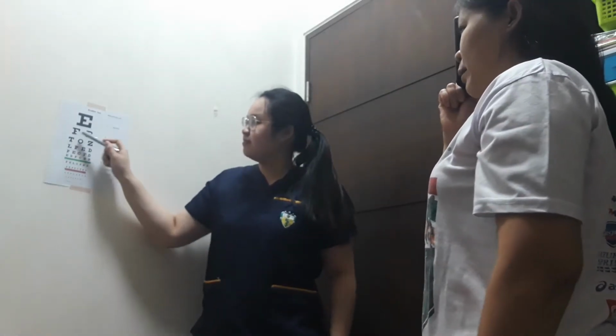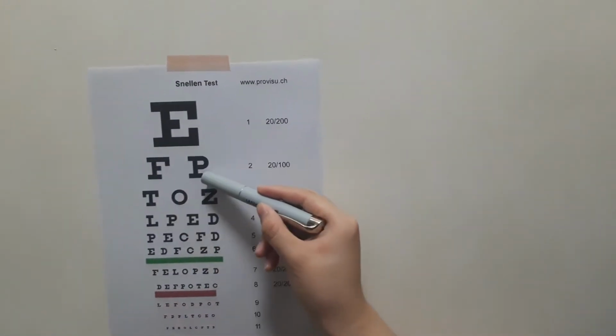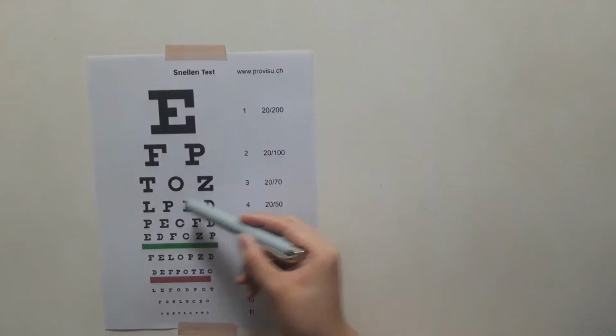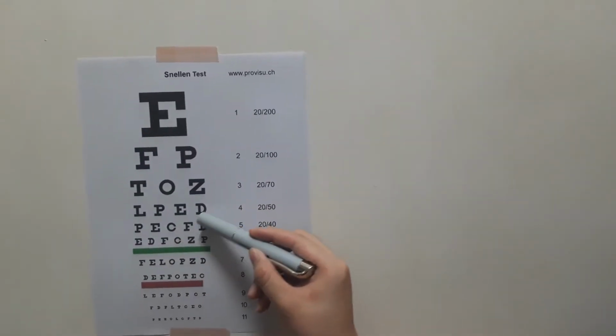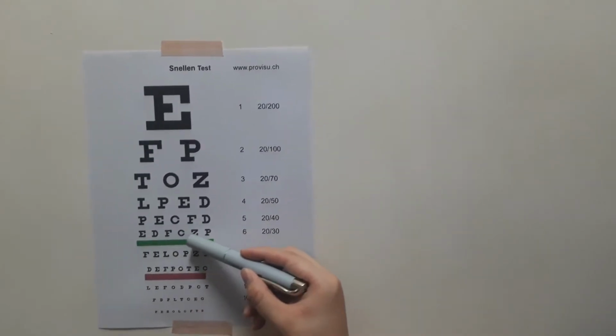Choose the lowest line wherein the majority of the letters are read accurately, with more than 50% of the line read accurately plus 2, and record her visual acuity as a fraction. Repeat the procedure for the other eye and interpret the results.